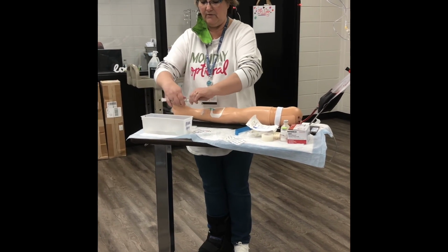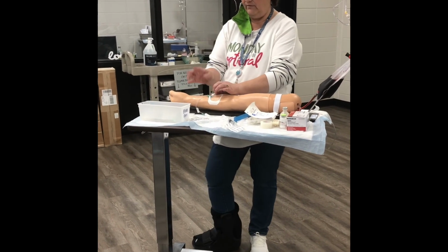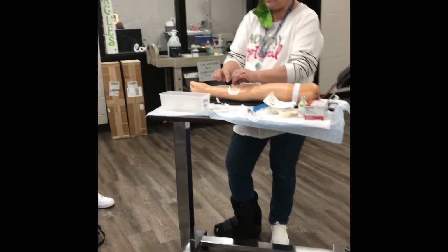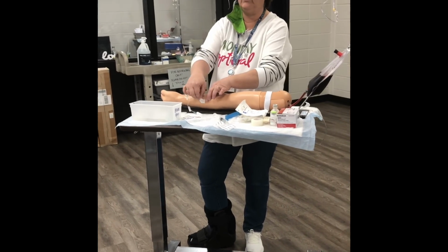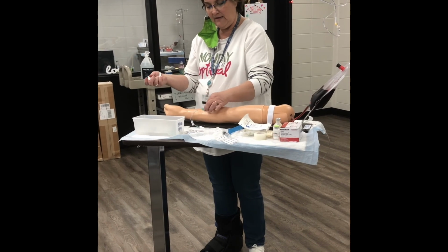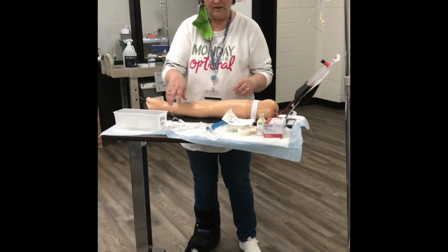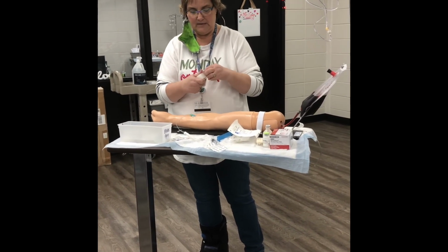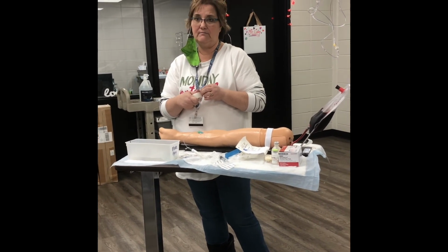All right, I'll go ahead and take this off. That can go in the sharps container. Now, as you peel this off, because these are not real skin, this does not stick to it as well. So as you peel it off, follow it with your finger, otherwise it's going to rip the dressing off your arm. And it's not your fault, it's just the way the equipment does on plastic. Then pinch it again and make sure, and you can take a piece of tape now and make your J-loop, or you can do it after you hook your fluids up. That's up to you.